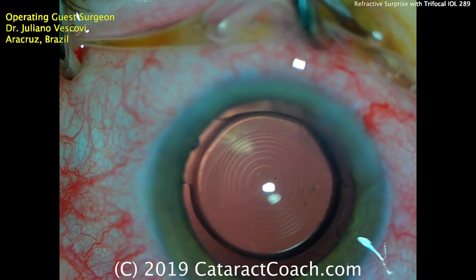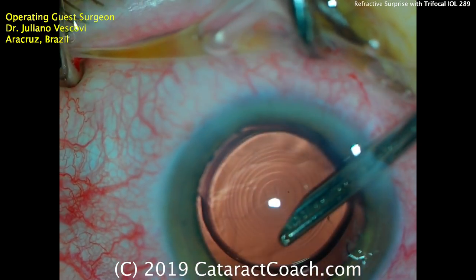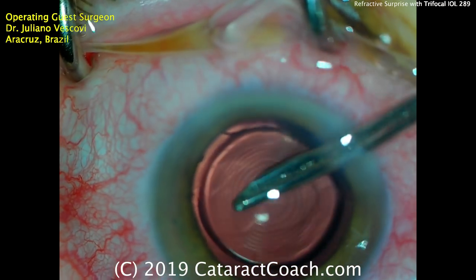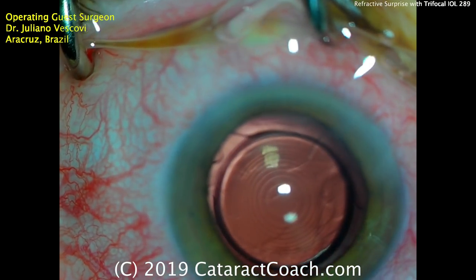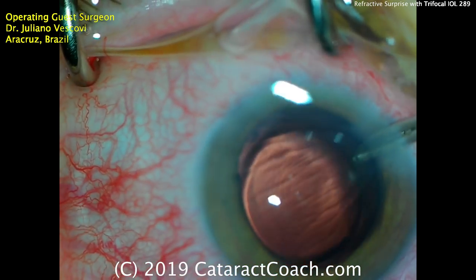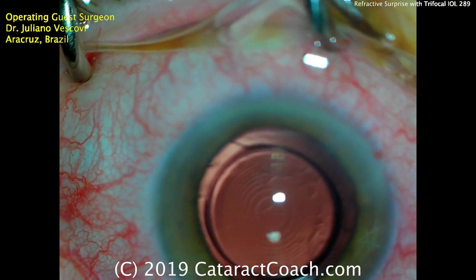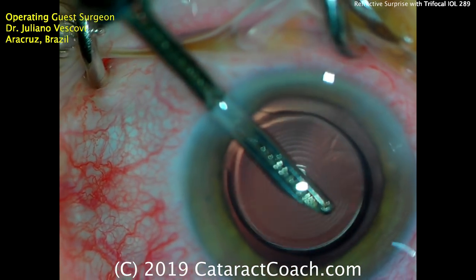The rest of the case goes beautifully without any complications. The patient had a beautiful post-op course — lens very well centered, no other issues. Going back to analyze all the calculations and data: what caused the refractive surprise? The patient ended up more myopic than anticipated. The 22.5 diopter lens was implanted, and instead of plano, the patient was minus 0.75 — meaning the IOL power was too high by about one diopter. Perhaps a 21.5 diopter would have been a better choice.